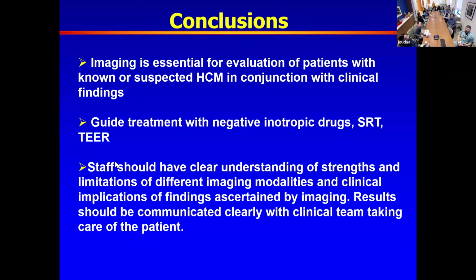Hi, Sherif. In terms of exercise stress for provocable LVOT obstruction and gradient, would you recommend treadmill stress or post-treadmill stress echo or supine bicycle stress echo, or it doesn't make a difference?